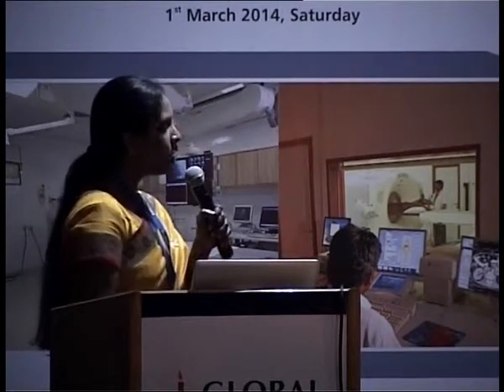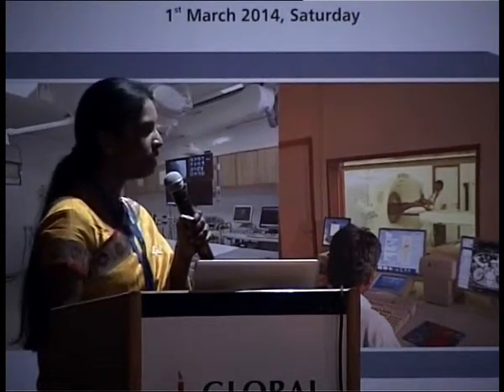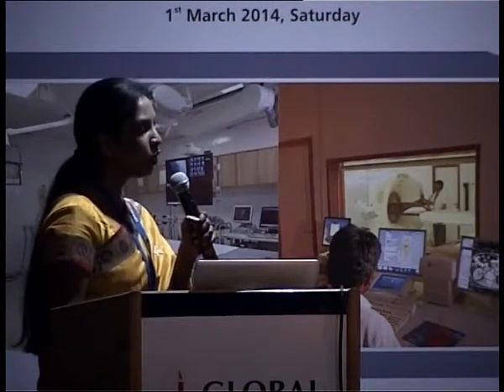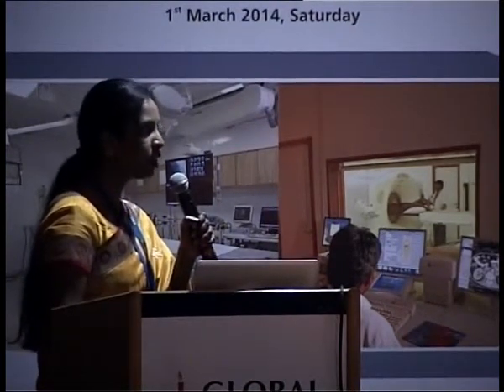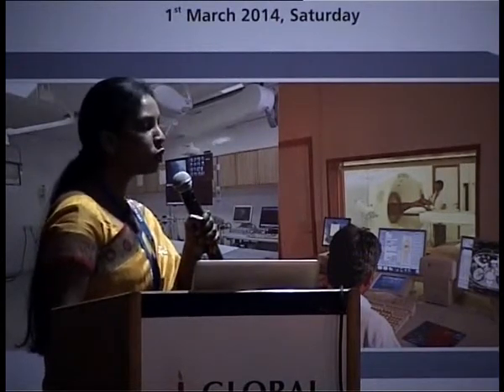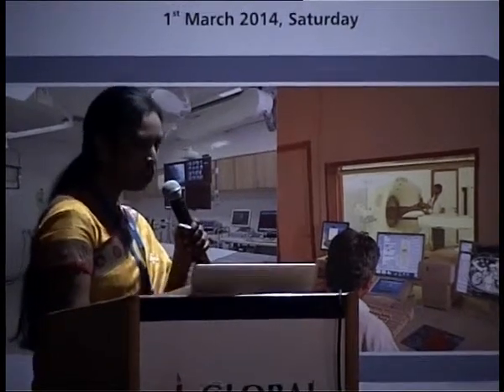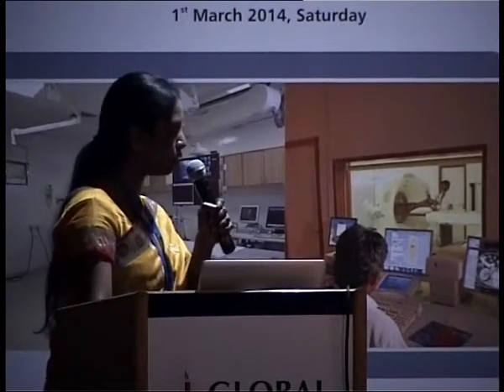So what MR imaging techniques do we have? There have been various contrast agents of late. We've used double contrast enhanced MR imaging, and the other advanced MR imaging techniques are MR elastography, diffusion weighted imaging, MR perfusion imaging, and MR spectroscopy. I'm just going to brief you about what each of these actually helps us with in advanced liver imaging.